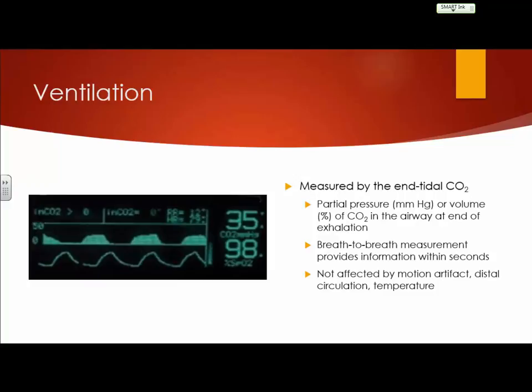So each waveform that we see, just like with a cardiogram or EKG, each time we see that complex, we're seeing real-time what's happening with the heart. We're seeing real-time what's happening with inspiration and expiration. It can give you a little bit of information on inspiration, too, and we'll get to that in just a little bit. All right? Not typically affected by motion artifact, distal circulation. Well, it certainly isn't by distal circulation or temperature.